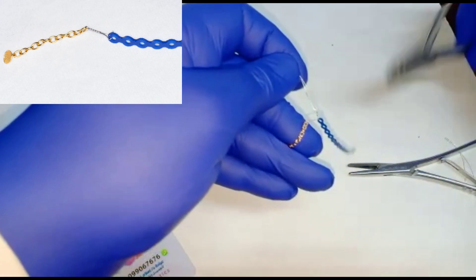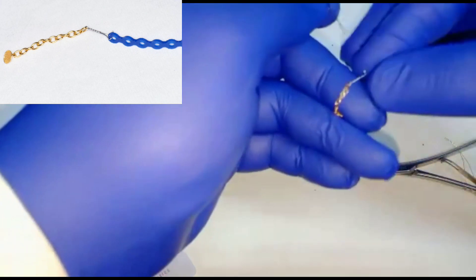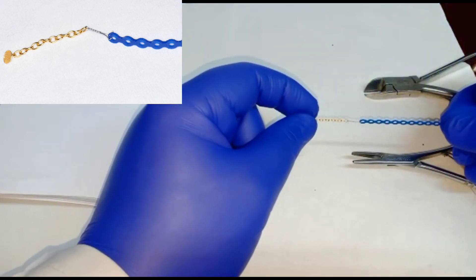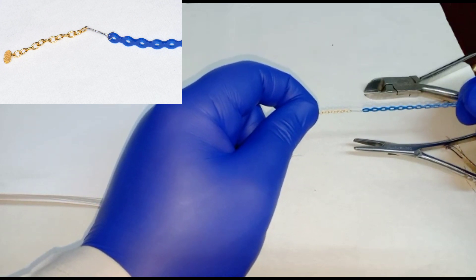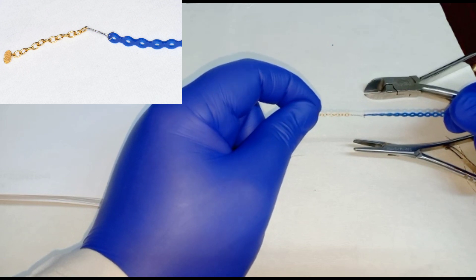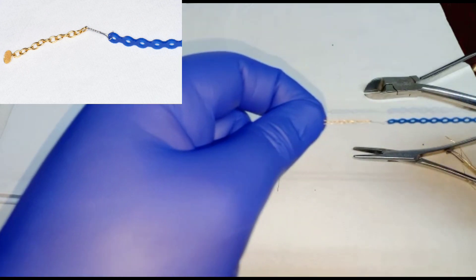We can cut the excess and put a little bit of flowable composite. Now the three are tied together — the power chain and the tie with the ligature wire, tied again with the first ring of the gold chain.